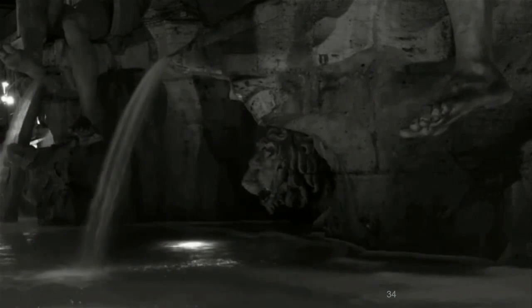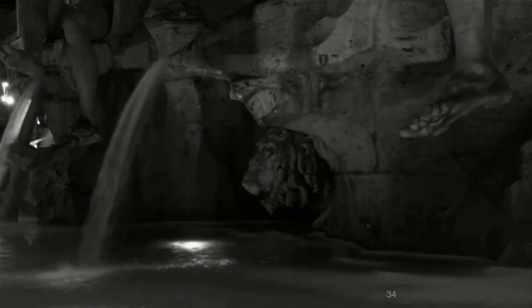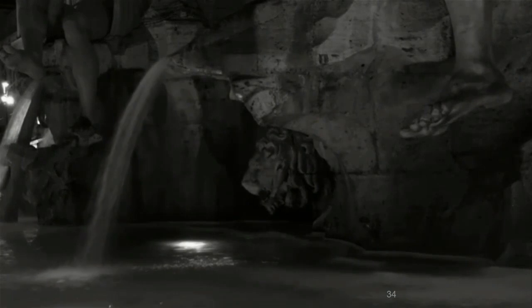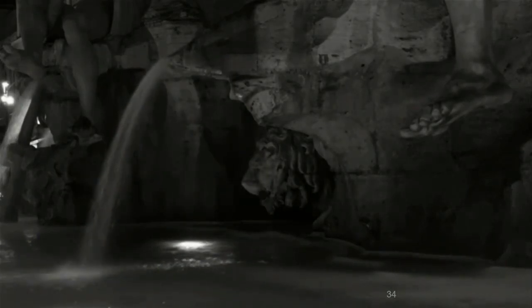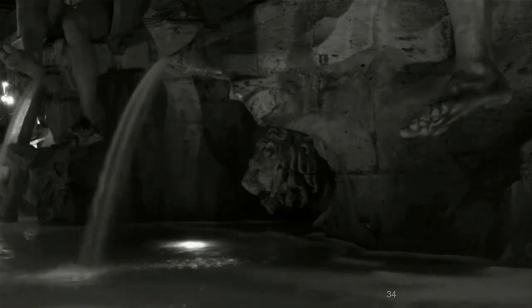So, since I was still in Rome, I went to the Piazza Navona and took a film of the Four Rivers fountain at night. And here you have a light source. Let's call that our OCTA, or OCT. Here you have the water running. We'll call that the vessel. Here you have the fountain, which is the RPE. And we can have this lion's head on the fountain, and we can call that a vitelliform lesion, or a fibrosis of any kind of reflective surface.